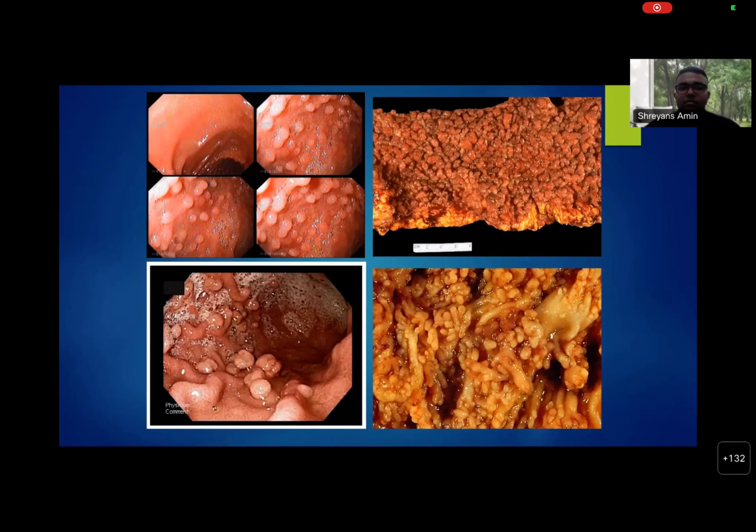And just for example, I have collated these 4 different images wherein the colon has multiple polyps. And Dr. Prachi is with us. I'm sure with her experience of so many years of endoscopies, she would be very good in distinguishing one condition from the other. Here we have one FAP, which is one of them. We don't know. Prachi would be able to say that. Then one of the conditions is a case of ulcerative colitis with inflammatory polyps. So a condition which is completely different from that of FAP, familial adenomatous polyposis, wherein you get numerous polyps which are carpeted on the mucosa of the colon, whereas the other condition is completely benign, which is an inflammatory condition.